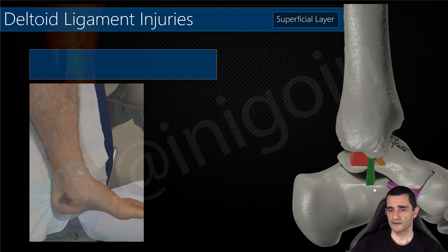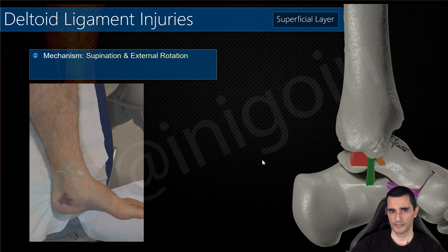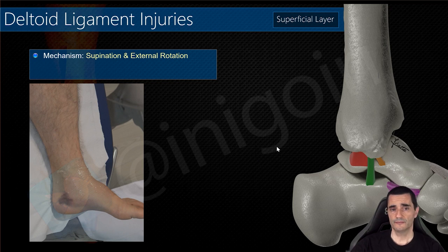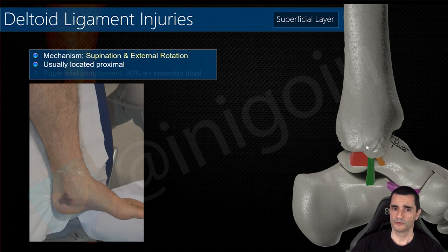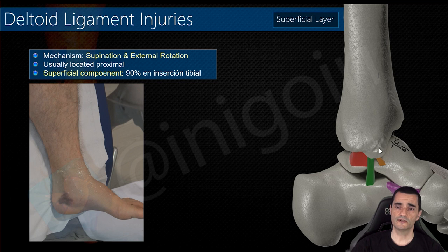In the superficial layer, we begin with the tibiocalcaneal ligament between the tibia and the sustentaculum tali. This superficial layer will be affected in mechanisms of supination and external rotation, and the location is usually proximal. 90% of the affection of the superficial layer will take place at its tibial insertion, so always check this area.